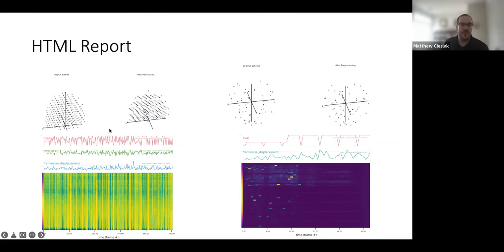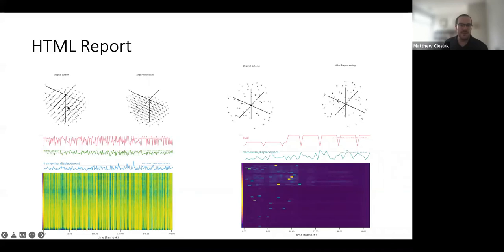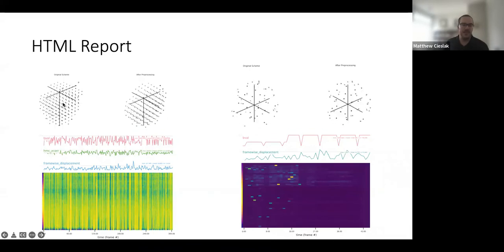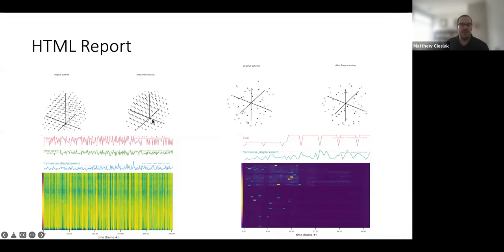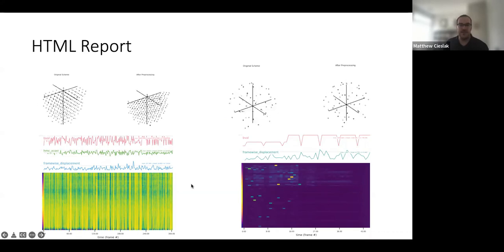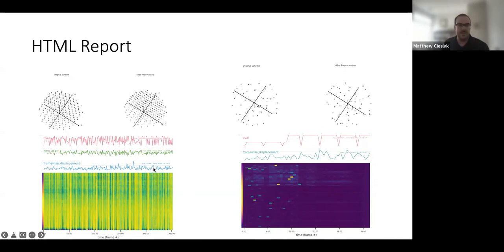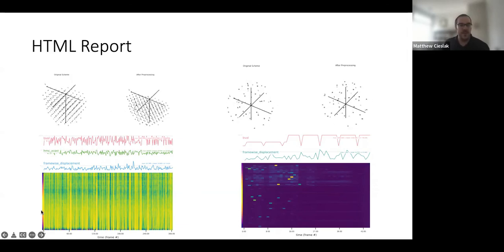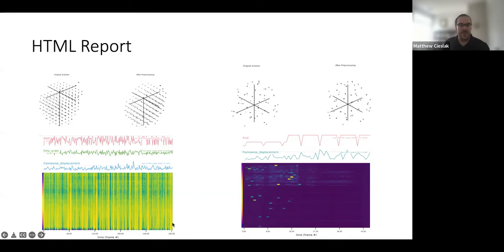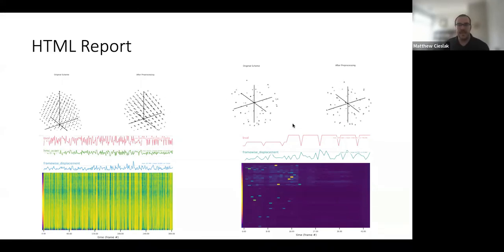This also shows, for example, here's one of those Cartesian grid schemes, and it rotates around in a little GIF, and it shows you what that scheme looks like after you've done your pre-processing. So here, this image got rotated when it was aligned to the T1 image and then aligned to ACPC space. So those b-vecs also have been transformed, and it's just a sanity check that that's happened. And since we used SHORELine for this, because we can't use eddy on these grid schemes, it shows you slice by volume what that slice's cross correlation was with the predicted image that came out of SHORELine. eddy shows something similar.